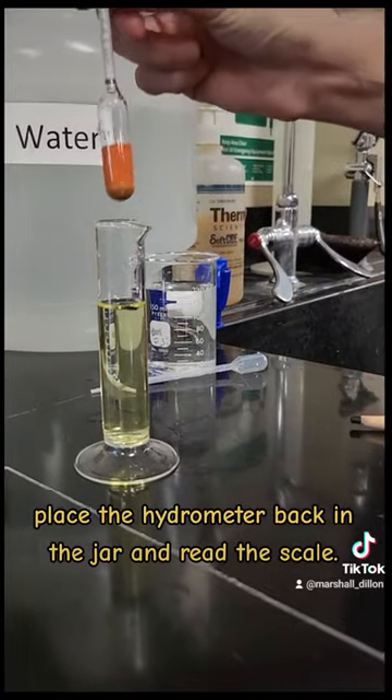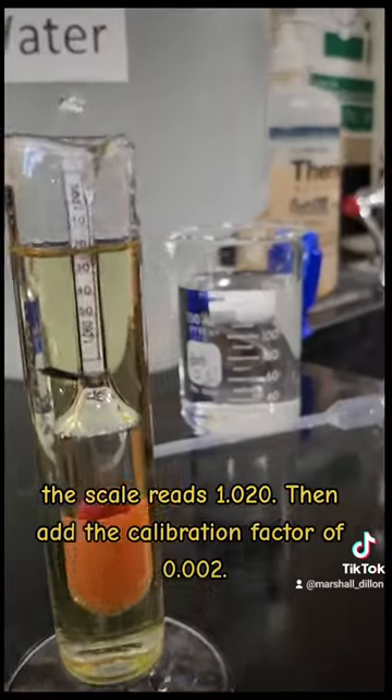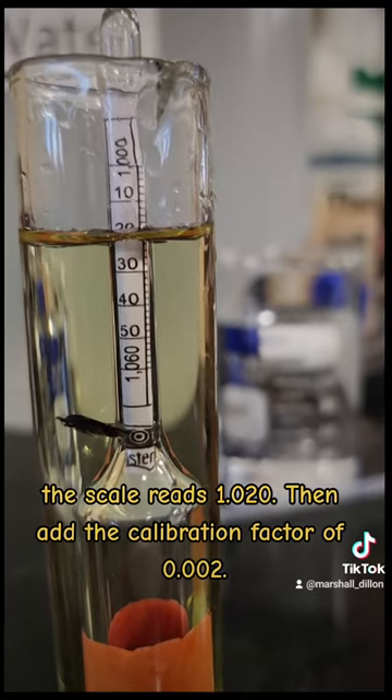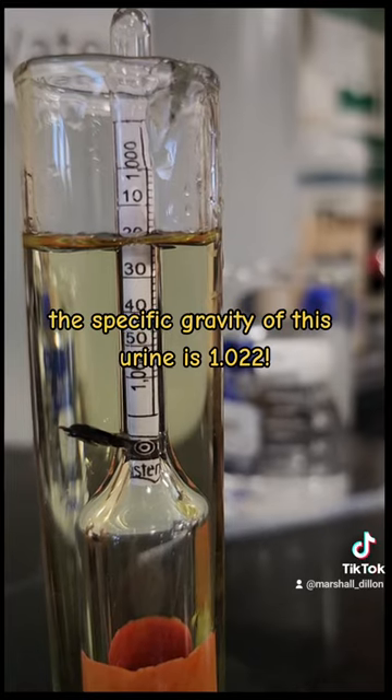Place the hydrometer back in the jar and read the scale. The scale reads 1.020. Then add the calibration factor of 0.002. The specific gravity of this urine is 1.022.